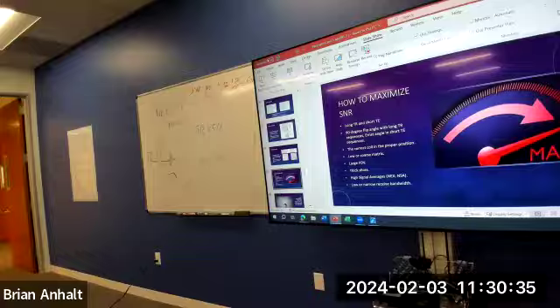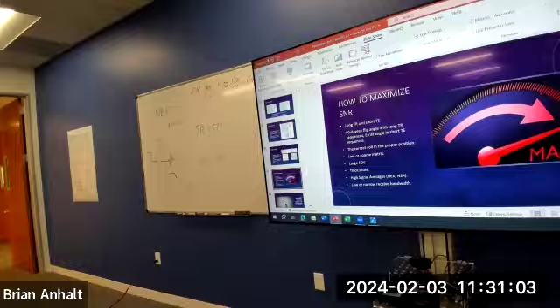You see the resolution? You gain more color with each box, and the smaller they get, when you gain more boxes, you'll be able to see more. But the smaller the matrix, basically the fewer pixels, the more simplified. So you go from all these different types of colors, and with a 4 by 4, it's like these 4. How can you get anything out of it? Keep up with the next slide.